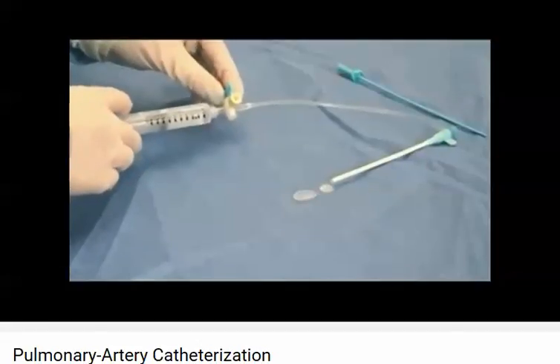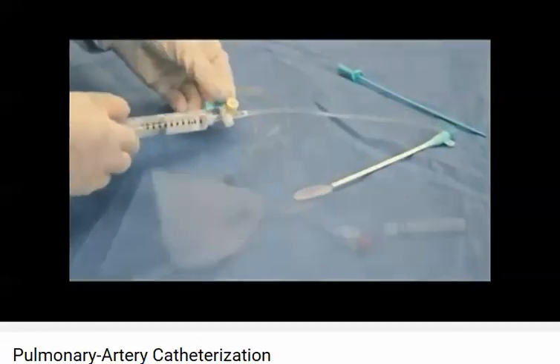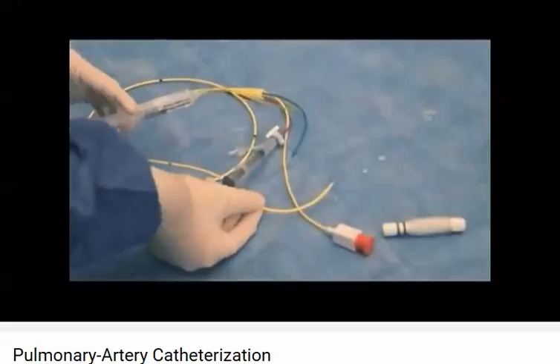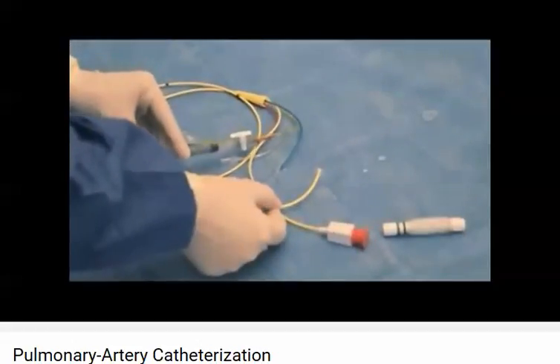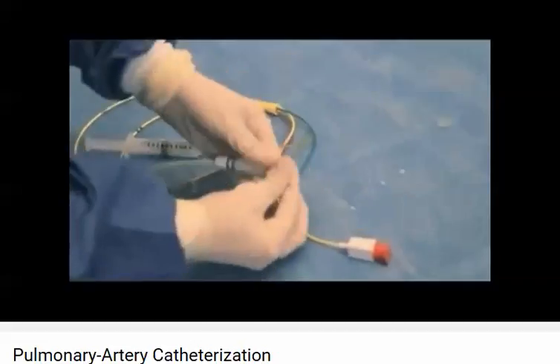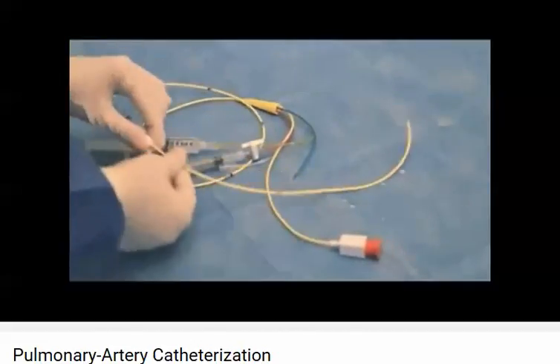Flush the ports on the sheath and the pulmonary artery catheter with sterile saline. Inflate the balloon at the tip of the catheter to ensure there is no air leak. And finally, slide the plastic sleeve over the catheter toward the ports.